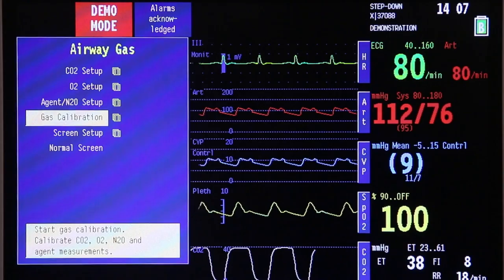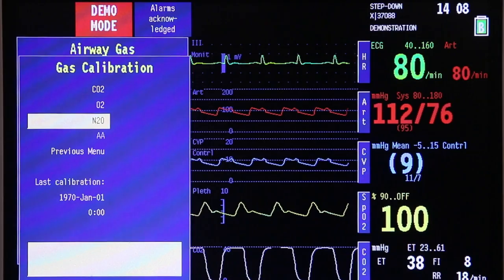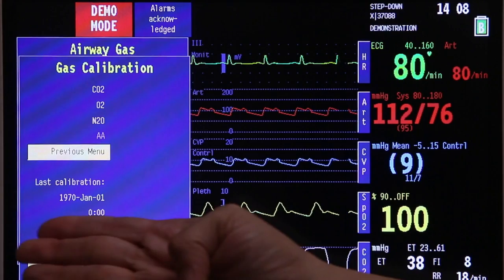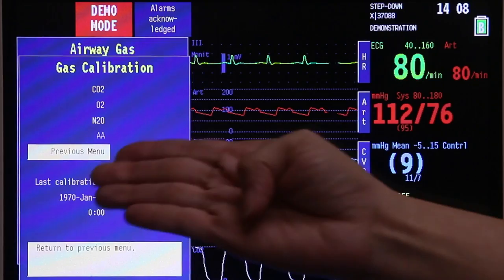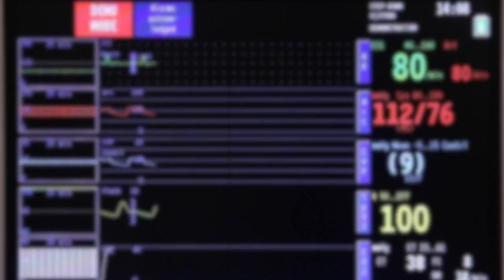Next up is gas calibration. Here, you will see the status of the calibration of the different gases you are monitoring. You can also see the last calibration time — for example, it was last calibrated on January 1, 1970 at 12 midnight. Once done, go back to the previous menu, and then go back to the normal screen.